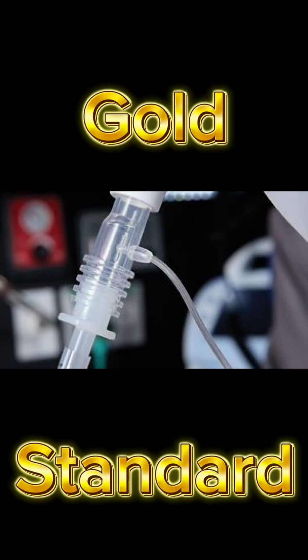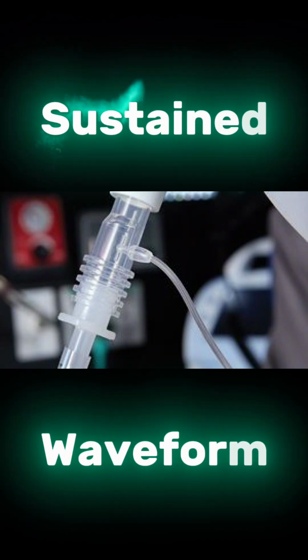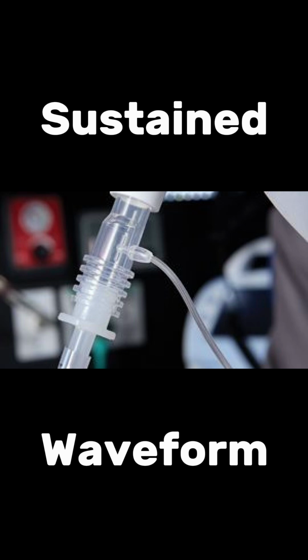Capnography is also the gold standard, as I said before, for confirming ET tube placement. Seeing a continuous waveform over multiple breaths confirms that carbon dioxide is coming from the lungs. In my practice, in the service that I work for, we use that terminology all the time. It's sustained waveform, not just a single wave, it is sustained.